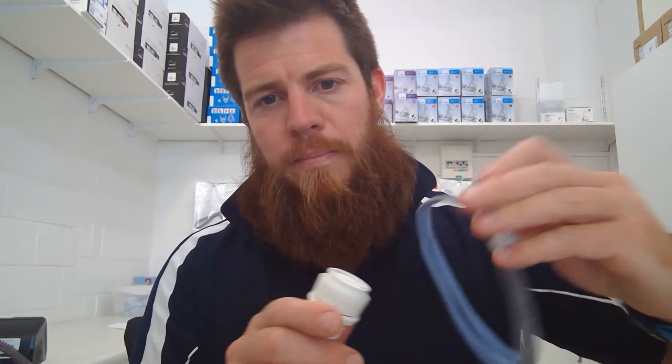The HumidX tabs just sit in here. Replace them every 30 days from when you open the packet — not 30 days of use, bear that in mind. They just click in like that. If you don't want to use the humidification tabs with the Air Mini, just take it out and reconnect your mask.